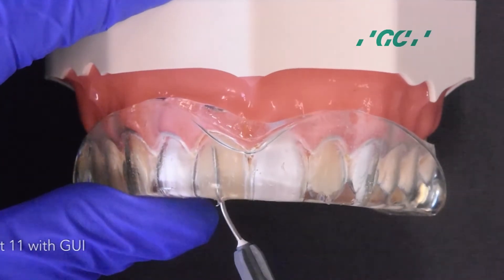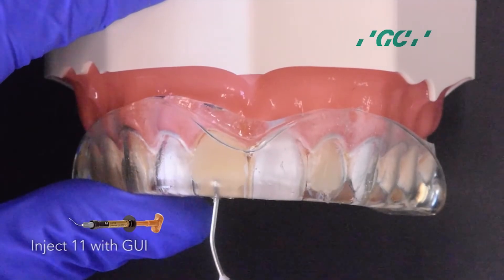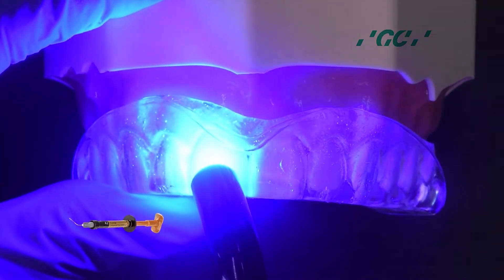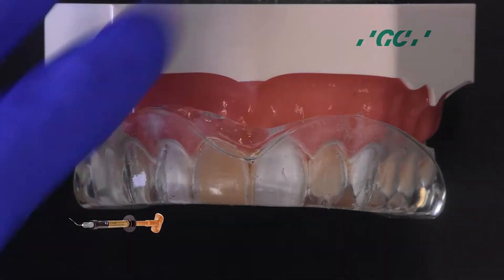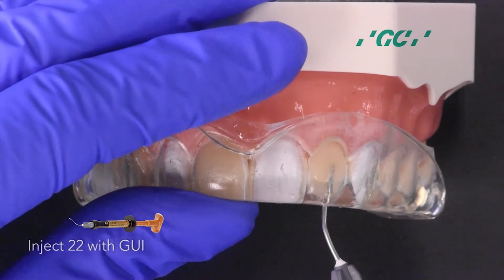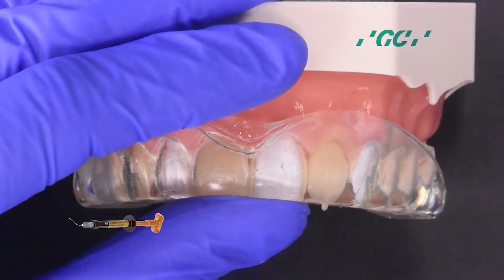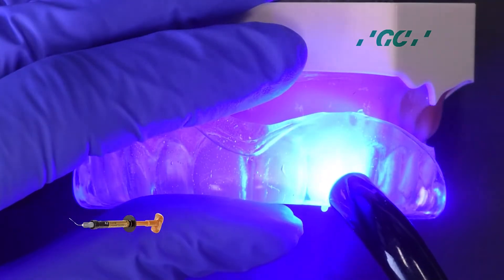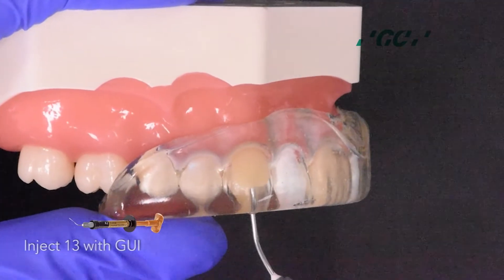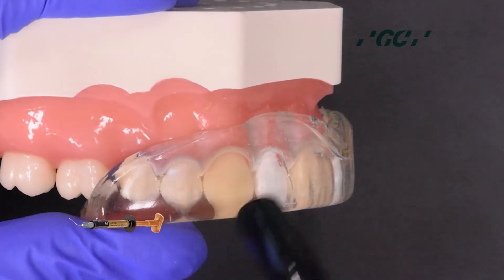Start injection molding on 1-1 with G-Aneal Universal Injectable, and light cure through the clear stent. Inject 2-2 with G-Aneal Injectable, then light cure.